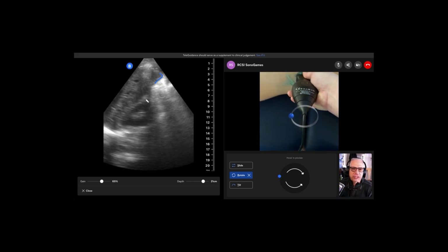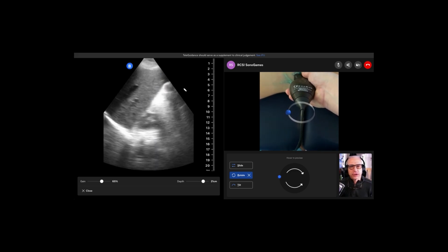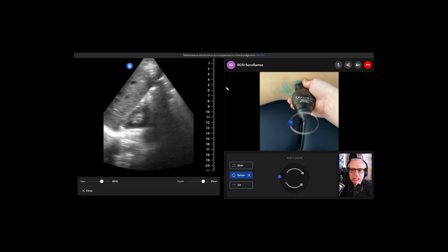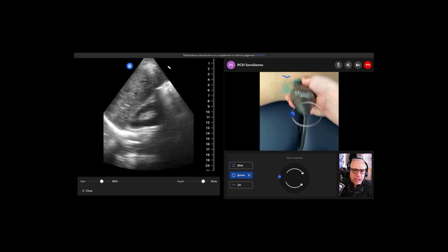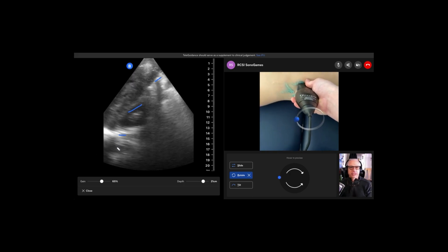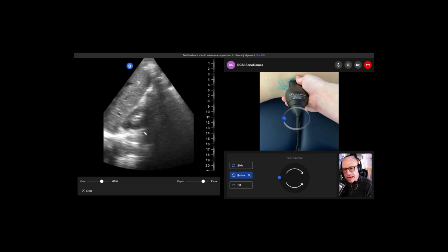So there's a really sweet image. There's your caudal liver tip. Here's your inferior pole of the kidney. Those are great places for fluid. I like this view when you're a little more anterior along the chest, because you get to look down and see all of those at the same time. Greg, nice to know you do not have blood in your belly.